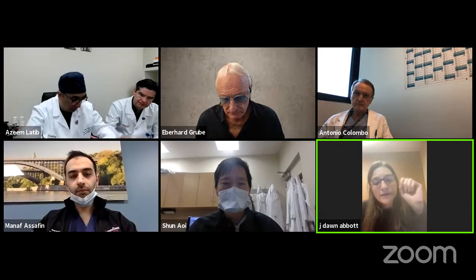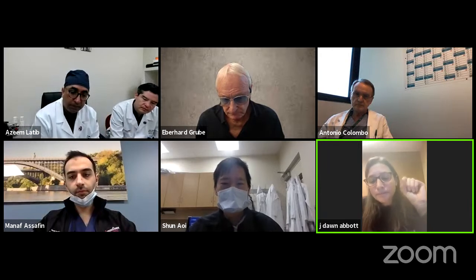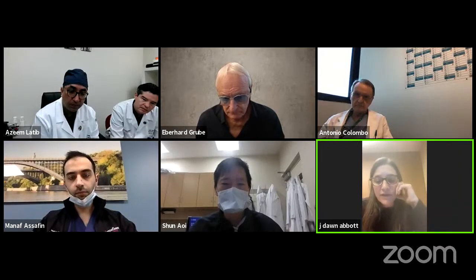You place the marker of your sized balloon inside the stent where you believe the ostium is, and then you hand inflate this circular large balloon, just what Dr. Colombo is talking about, to purposefully longitudinally deform, or flower, the stent that is in the aorta back onto the ostium of the aorta.